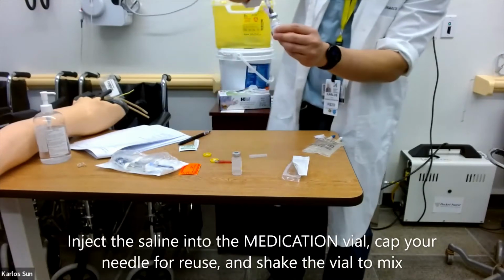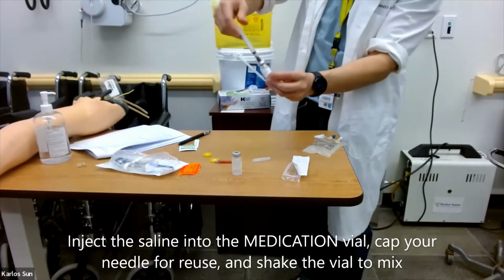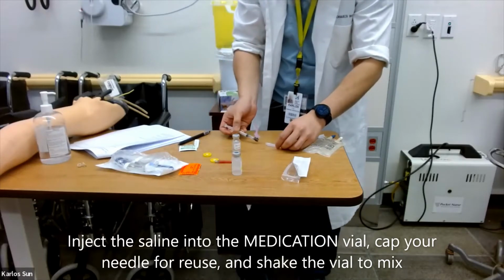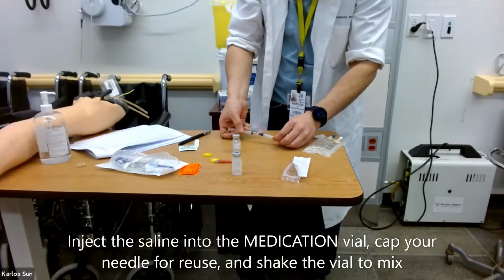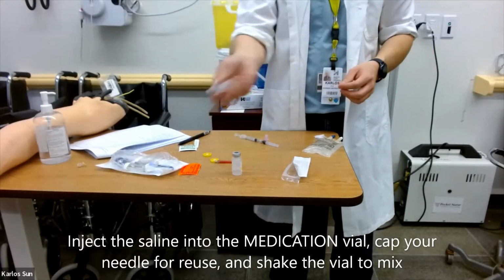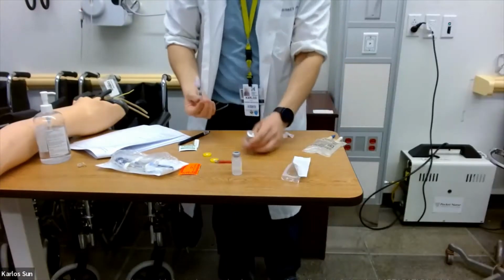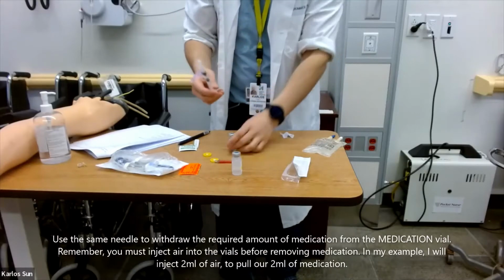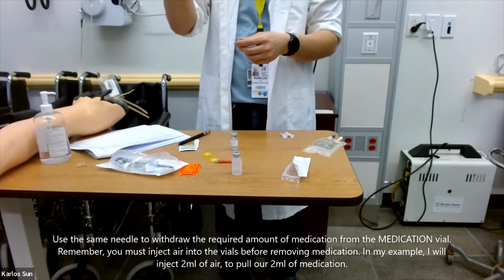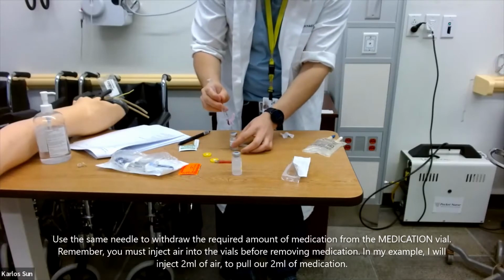Inject the saline into the medication vial, cap your needle for reuse, and shake the vial to mix well. Now use the same needle to withdraw the required amount of medication from your doctor's order from the medication vial. Remember, you must inject air into the vial before removing medication.